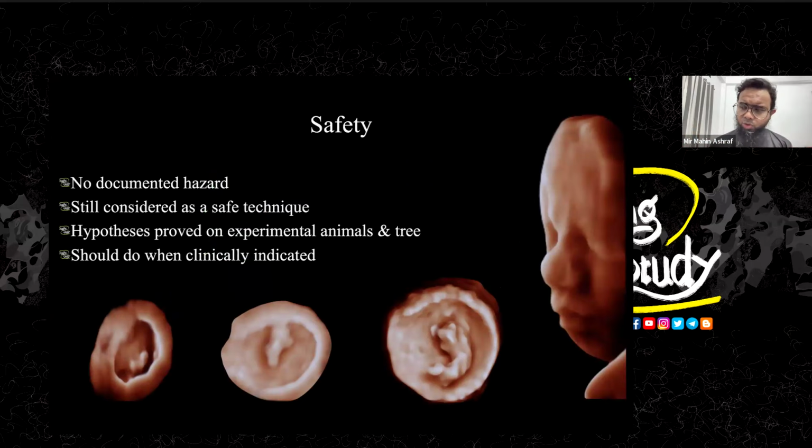Even Patrick, who actually discovered the fetal sleep stages, tried ultrasound for 50 long hours in a single patient, but there was no adverse effect. Even for my baby, I think I've gone through more than 28 ultrasounds, and there was no adverse effect, because I know there will be none.